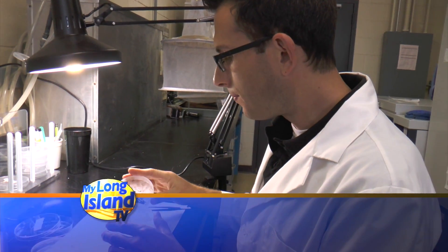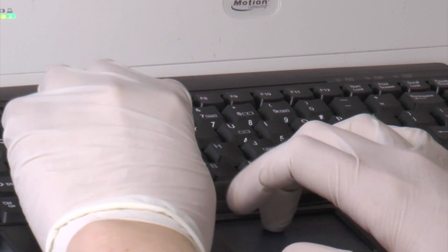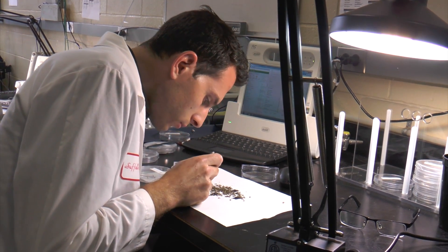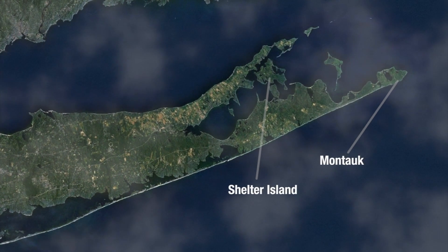I'm a biologist here in the lab. During the season, I do a lot of the same things that the interns here do, and I also help out with a lot of the data analysis. During the off-season, I do some field work. Right now I'm doing a lot of traps on the South Fork, all the way to Montauk, Shelter Island, and back.